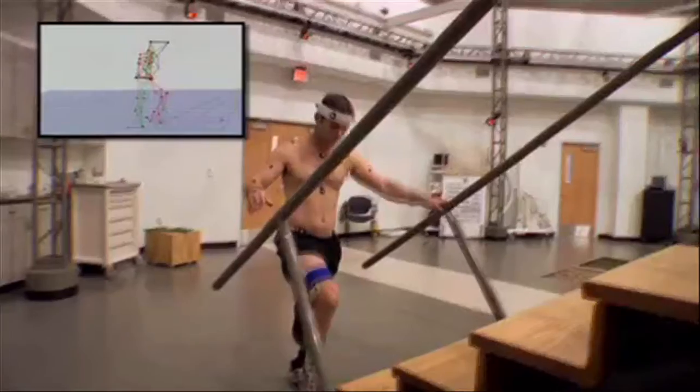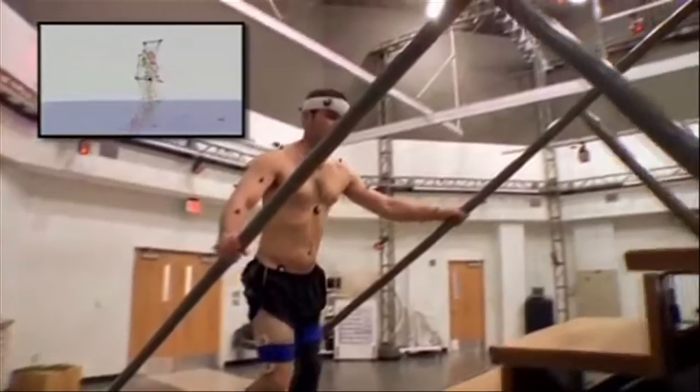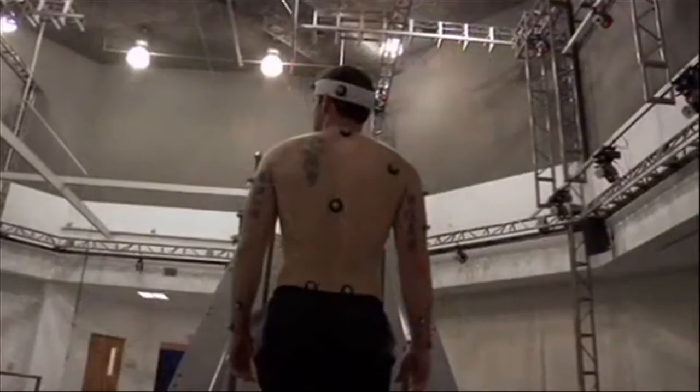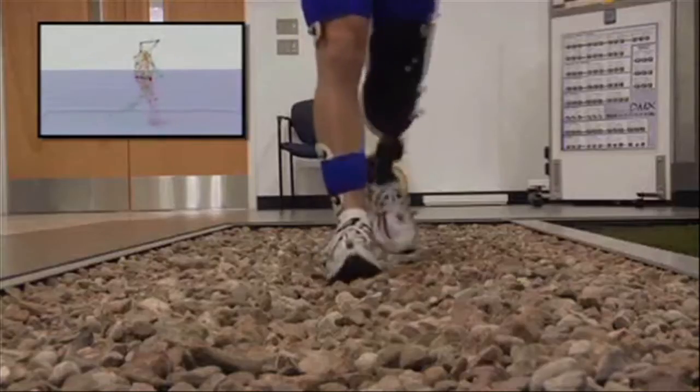Typically, biomechanics and gait — the measurement of walking motion — is measured in a video gait laboratory. Part of the process of measuring the biomechanics of any subject in a gait lab is to collect the forces from the foot.